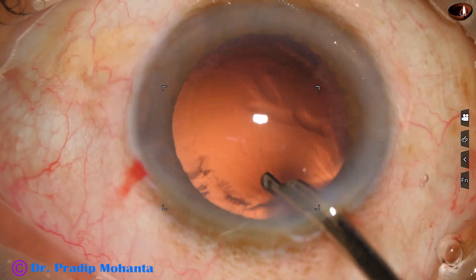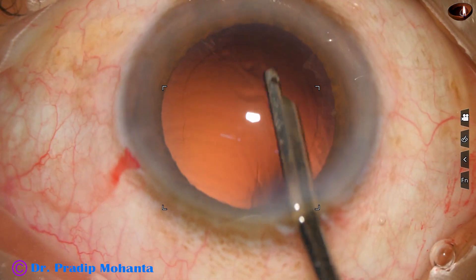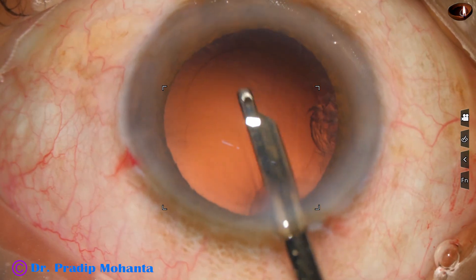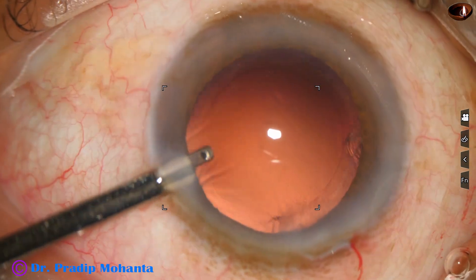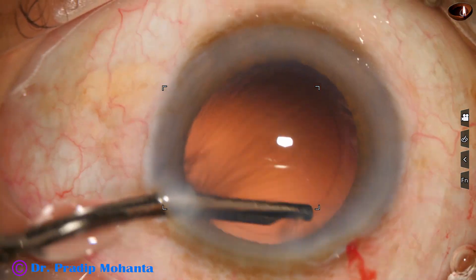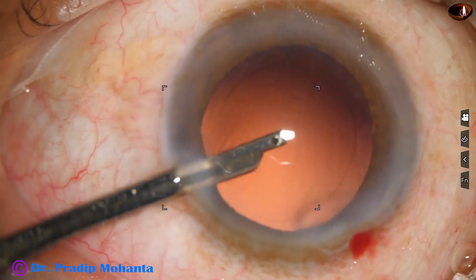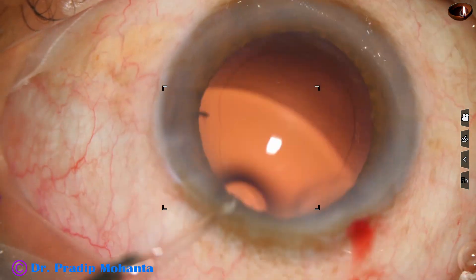And now this is cortex removal. Most of the cortex is removed — only a small bit of cortex remains. I go through the side port and remove this cortex. Subincisional cortex — a bit of cortex at 9 o'clock — is removed. Clean bag now.